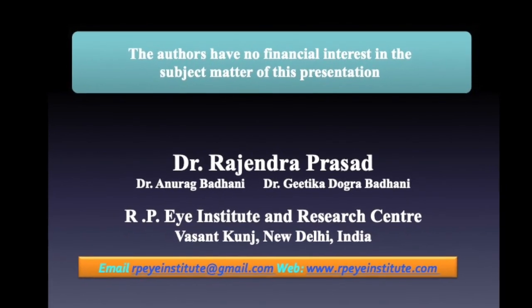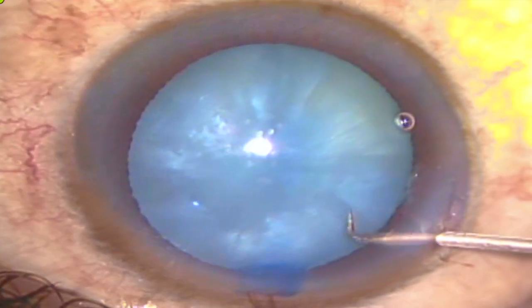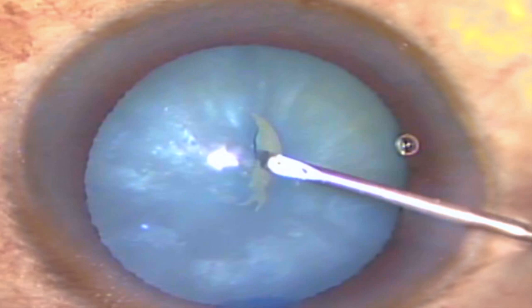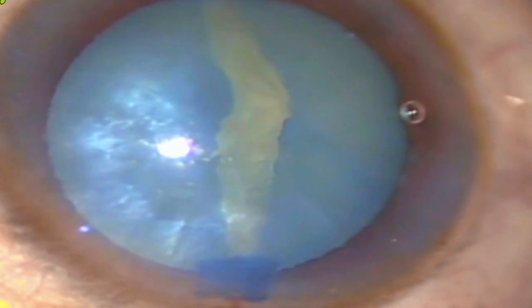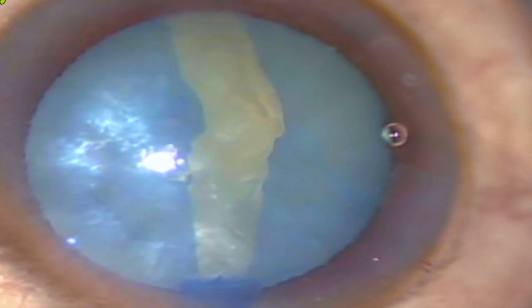The authors have no financial interest in the subject matter of this presentation. The Argentinian flag sign is a self-propagating radial extension of anterior capsular tear, which typically arises with an initial puncture of the trypan blue stained anterior capsule in patients with intumescent pearly white mature cataracts.